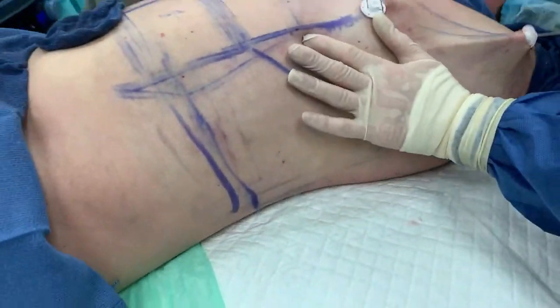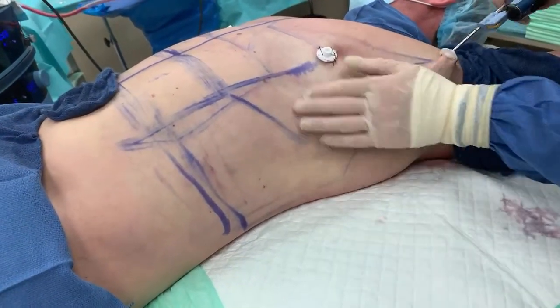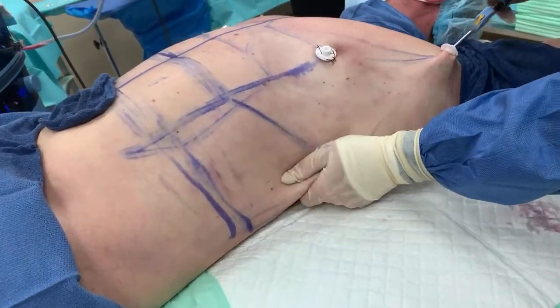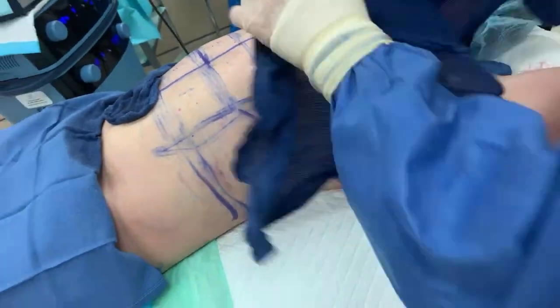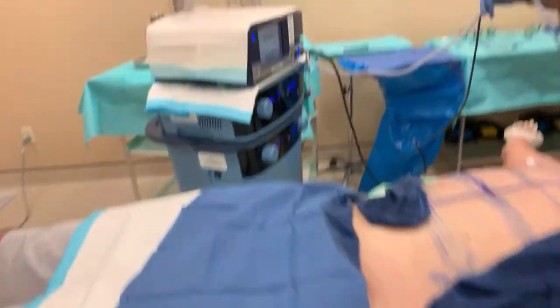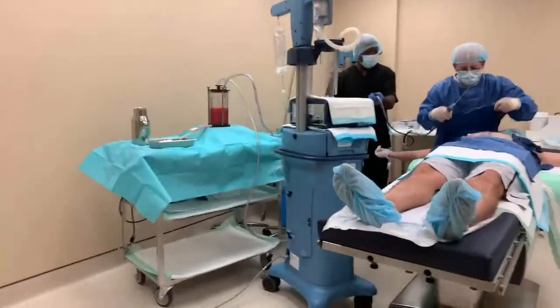See how I feel the space here? That's what I want — we're going to get that even more. We are about there. Let's go back to the other side. Now it's ready.